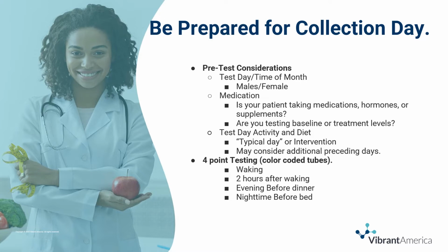And it is also important that your patient is aware that they need to collect at 4 different times during a day. The first collection will be immediately upon waking before any activity takes place, a second collection 2 hours later, a third collection in the evening before dinner, and a 4th collection at night before bed.